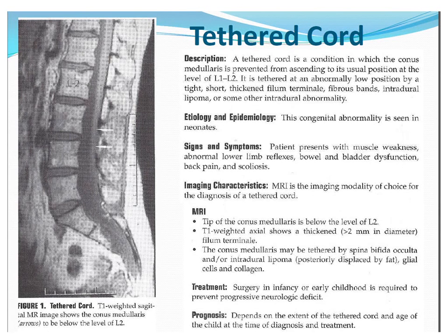The last thing you might want to consider is continuing the axial imaging down through the level of the defect, if there is a defect in the posterior elements of the spine. And probably, if they're planning on evaluating it for a patient that was screened with ultrasound, you may already be aware to go that low. But if you're just seeing this and it was an undiagnosed thing, if you see a very low cord below the L2 level, you might want to think about going lower or checking with the radiologist to see if they want to image any lower and see if there is any defect in the spine itself.